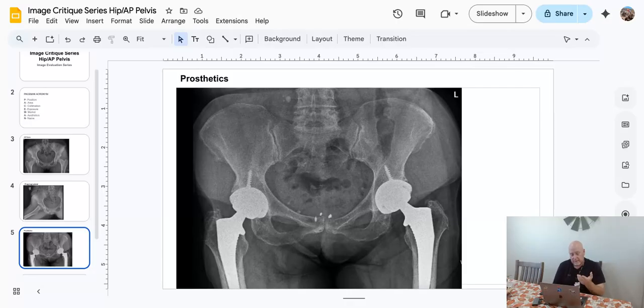The reason I'm showing you this is we haven't included the distal prosthetic ends. Okay, you take this picture, it's actually okay, but you're going to want to take one a little bit lower. You're going to keep this picture, but you're going to bring your tube a little bit lower. Okay, so you're going to probably cut this off right here at the iliac crest, and that's okay, just as long as you're seeing the bottom of the prosthetic.